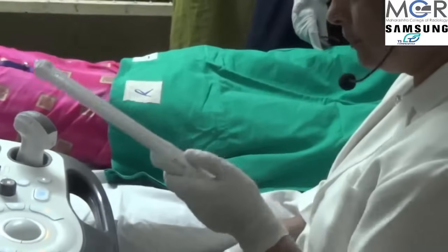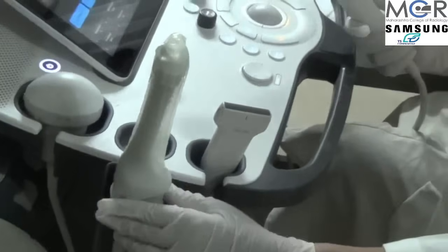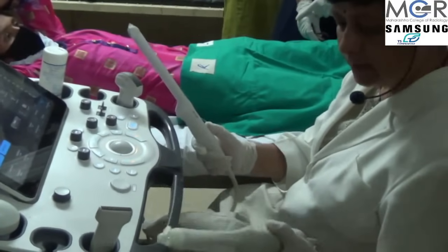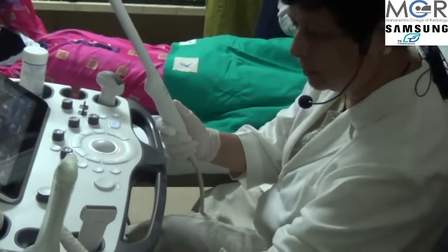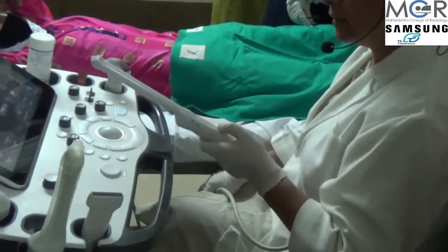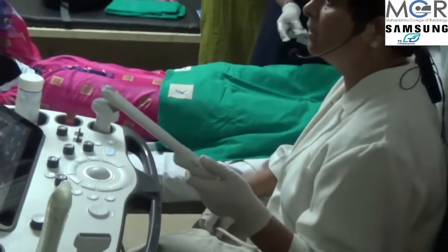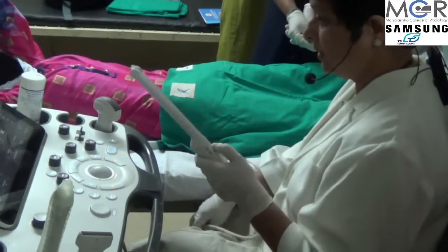Coming to the transvaginal probe, we have two types of TVS probes: this one is the 3D/4D volume probe and this one is the regular 2D probe, both of different frequencies. We can make a choice as per what we need. We have already seen the patient from the abdomen, so we know how her uterus is and can accordingly select the type of probe if we have the option.